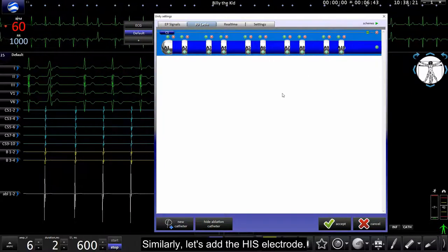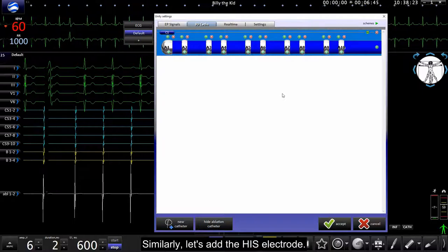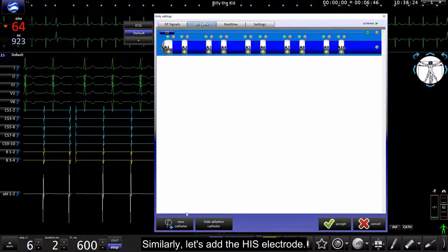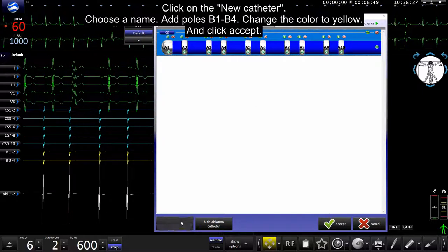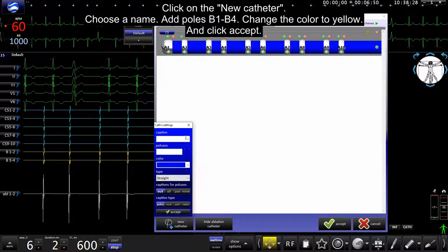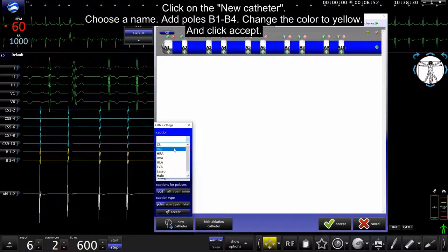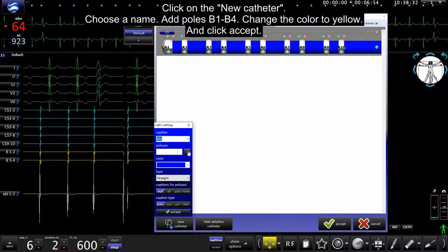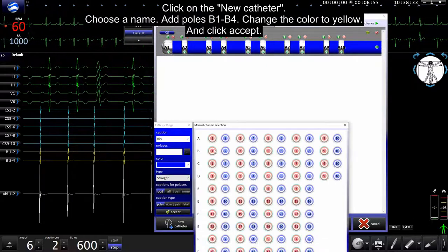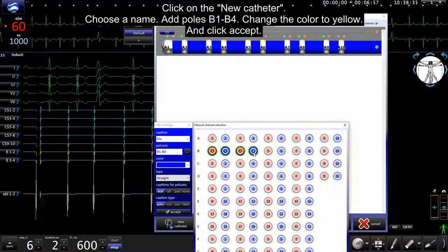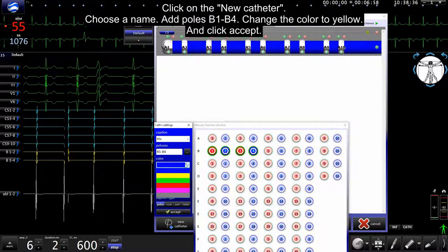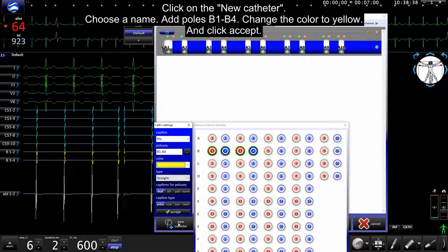Similar way, let's add the his electrode. Click on the new catheter. Choose the name. Add poles B1-4. Change color to yellow and click accept.